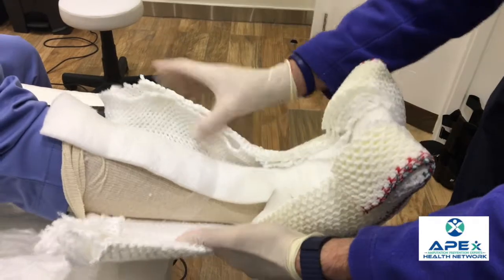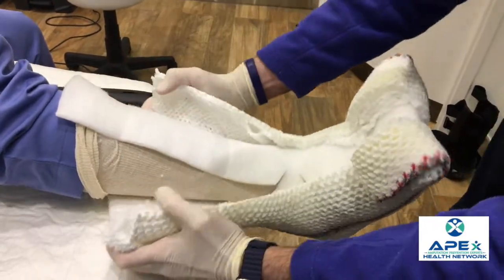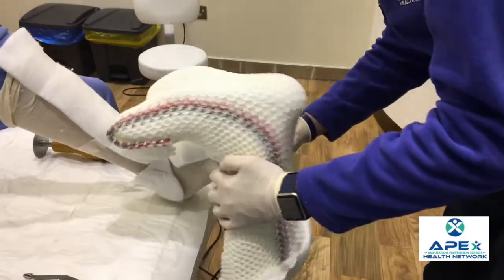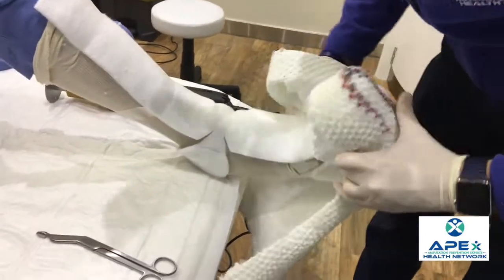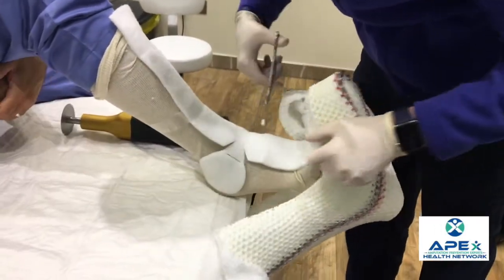What I usually do is spread this with my hands. I'll have the patient lift their leg — you may need some help from somebody else. You just need to get the heel out first, and once the heel is out, you can turn the cast this way. You may still have some padding or tape stuck on here, and once the cast is off, you can cut through the rest of it.